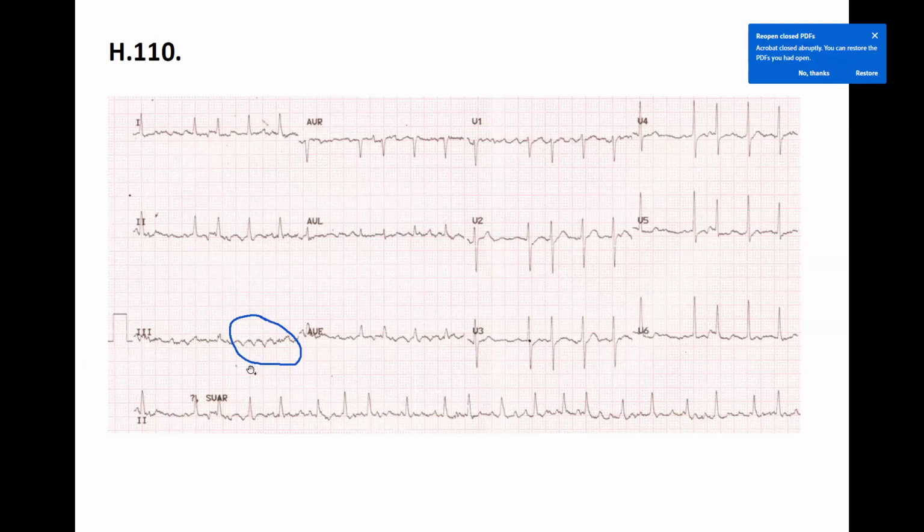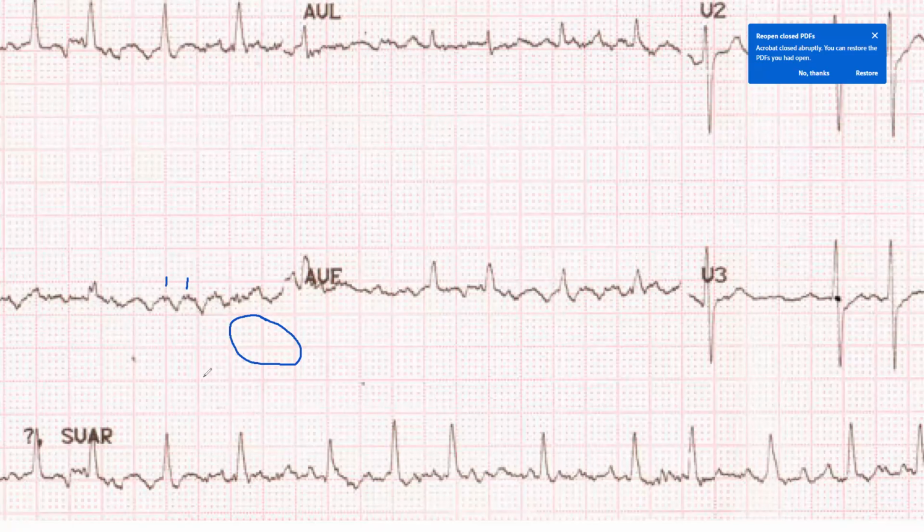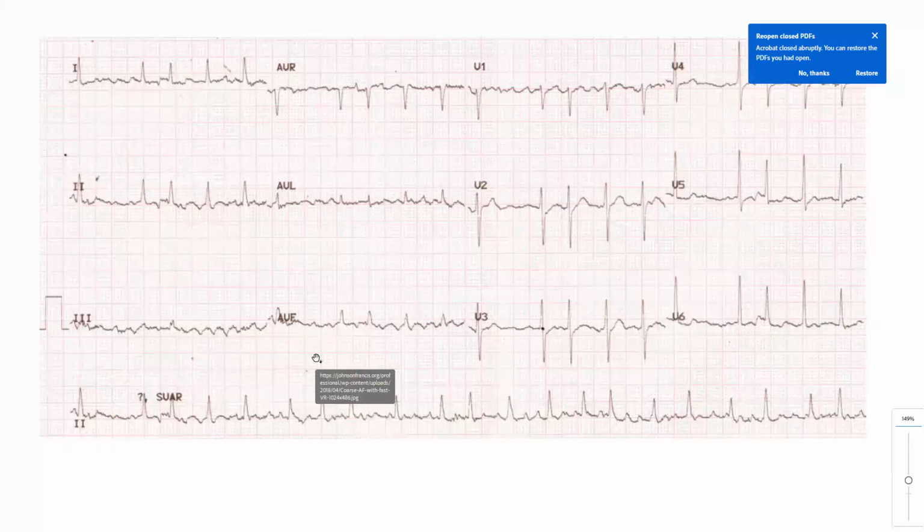Get closer and determine the heart rate, I mean the atrial rate. This is faster than 300, 350. Oh, so then it would have to be AFib. Exactly. Arrhythmia and an atrial rate of more than, for example, 300, 350, you should go for AFib. Very good.